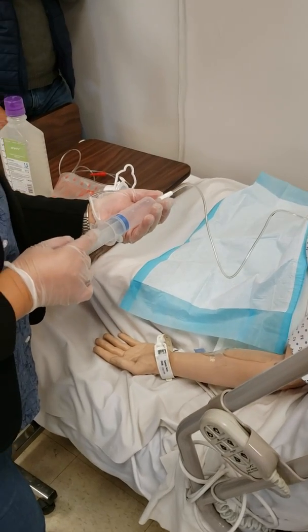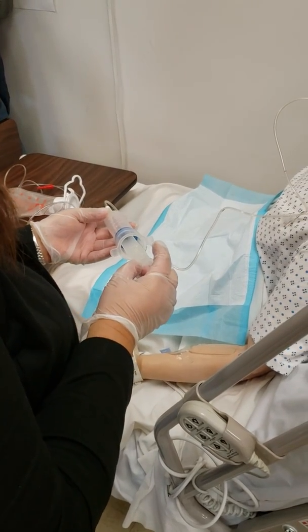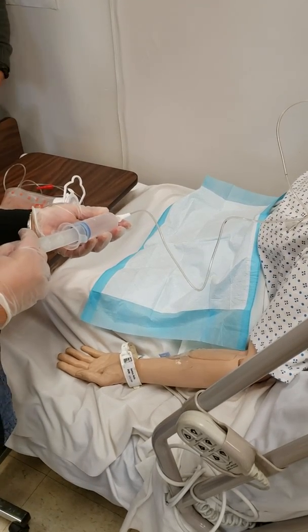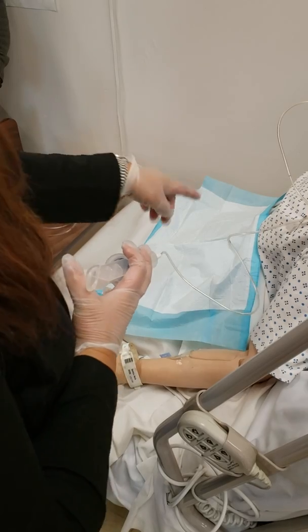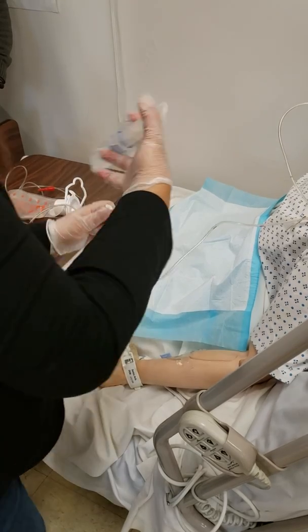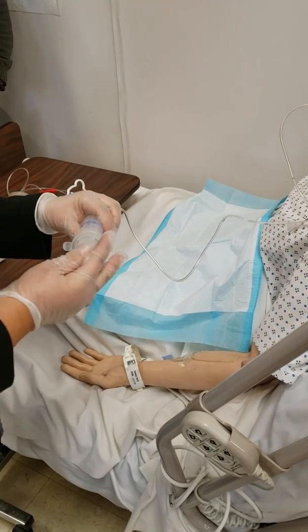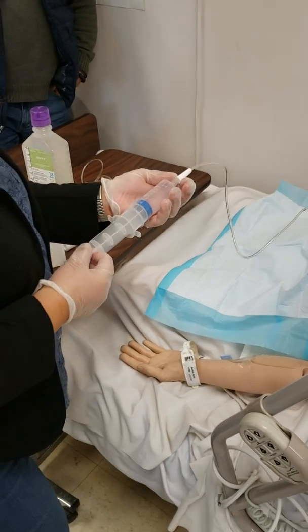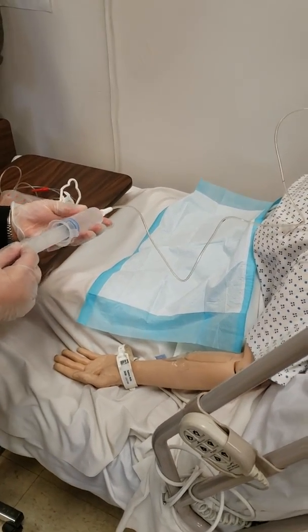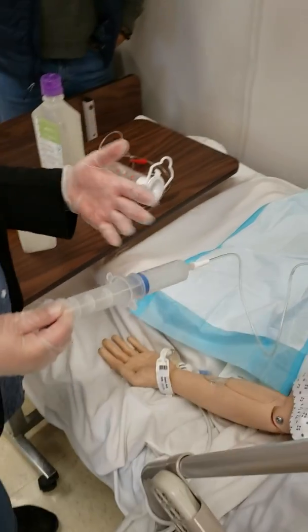All right, so this one has a capacity of 60 cc or 60 ml. If you reach 60, that's the maximum, and you don't feel any resistance, that means you have more inside the stomach. So you will kink this again, put this amount over here, and then aspirate again. If you reach 60 again, and you still don't feel resistance, that means you aspirated 120. So that's more than 100.